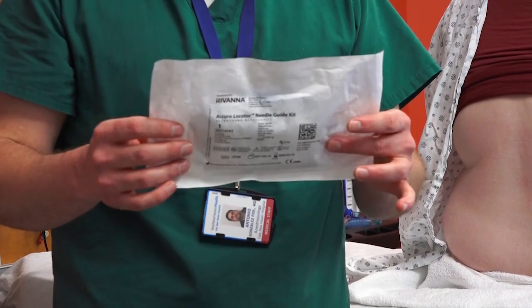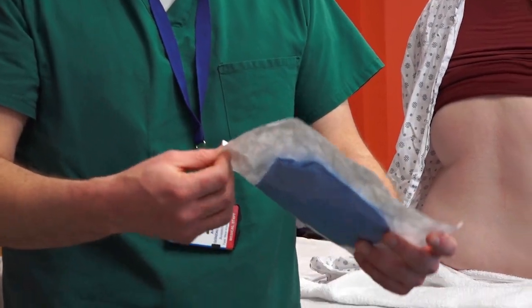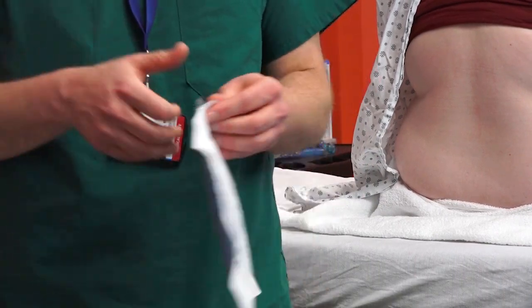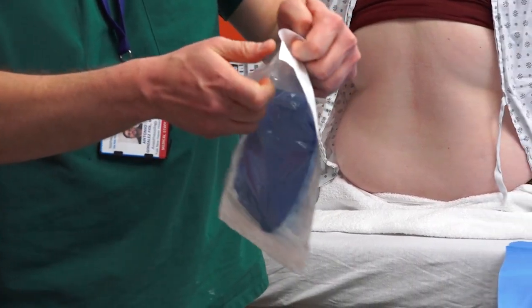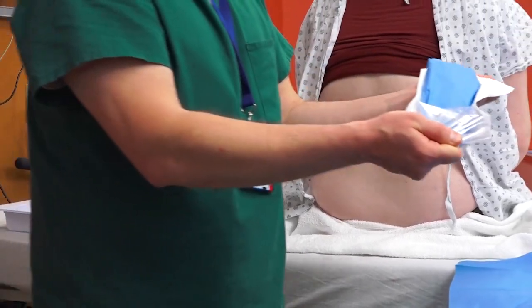Acuro has created a sterile sheet cover that fits perfectly to the device and can be placed single-handedly by a provider without the need of any help or assistance.